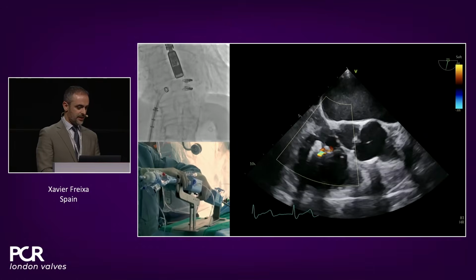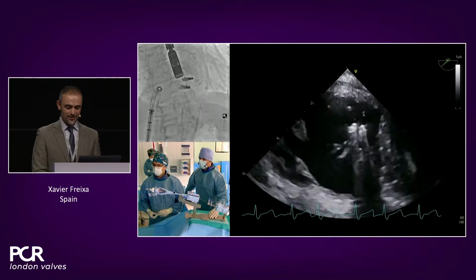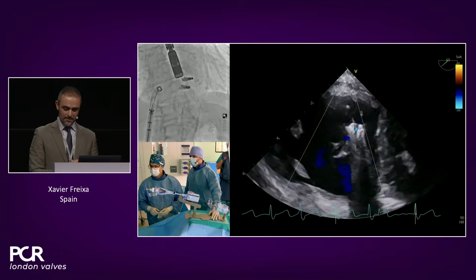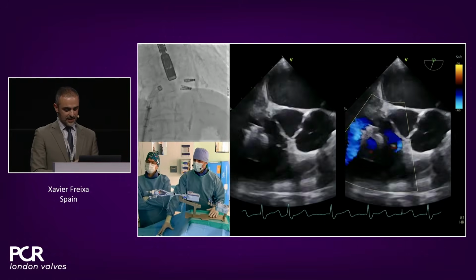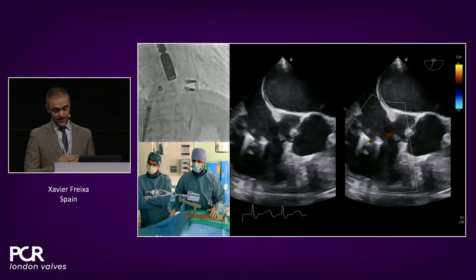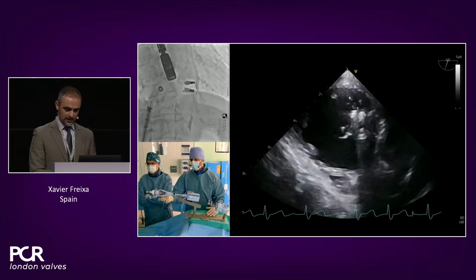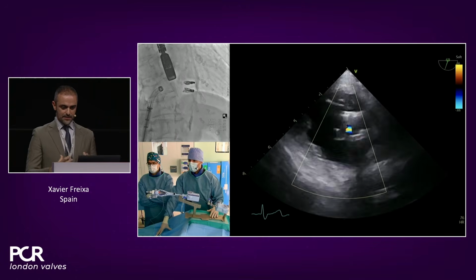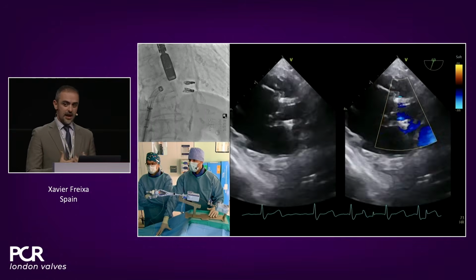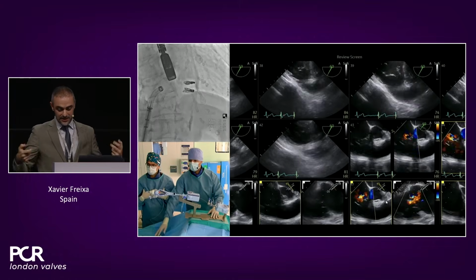And what we saw after releasing the second clip is that we have, as we anticipated, this anatomical correction. Now the color went back to our very last grasping. So in a sense, we had this reduction of 3 degrees from massive to, I don't say trace, mild, I don't know, but something between these 2 degrees. Good grasping, good tissue inside, following our initial plan, and especially, we feel safe that these clips are going to hold the future pressures of this coaptation gap.